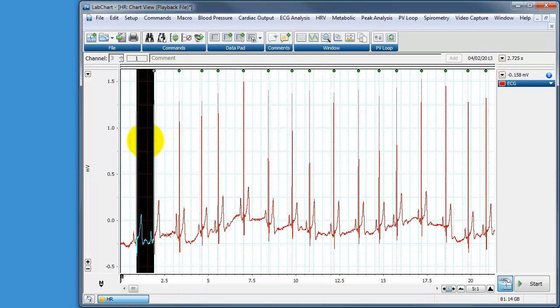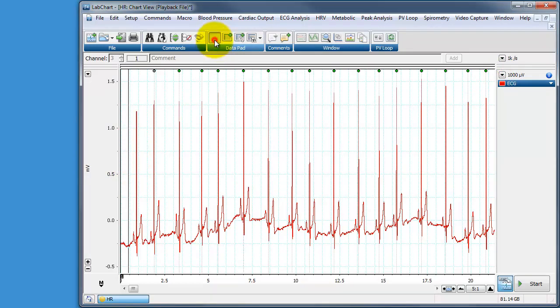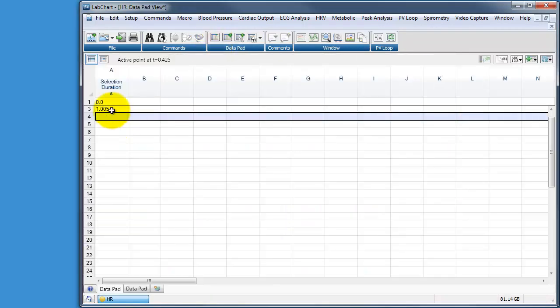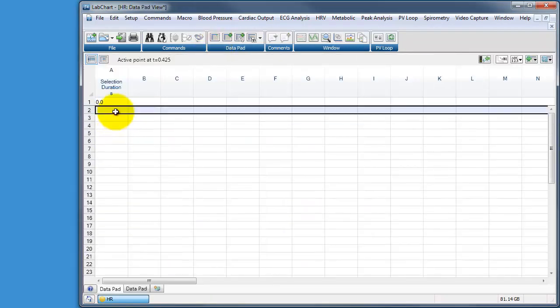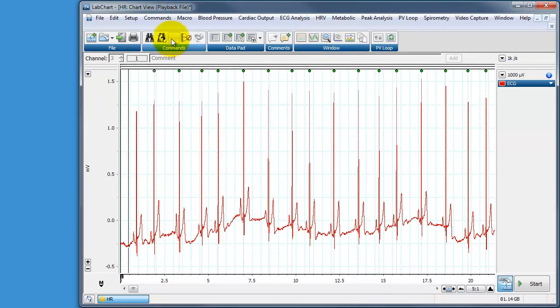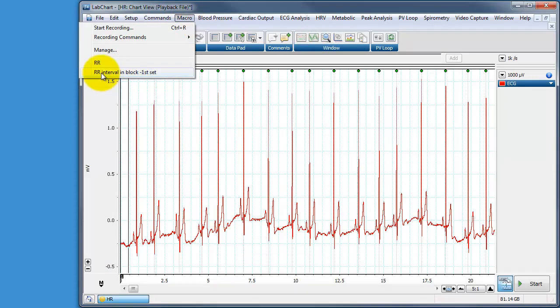So let's just see if this works. So we select the first part of the block, go to data pad and let's just delete that point so we've got a clear data pad. Go to the start of the block, go to macro and run this rr interval in block first set macro.